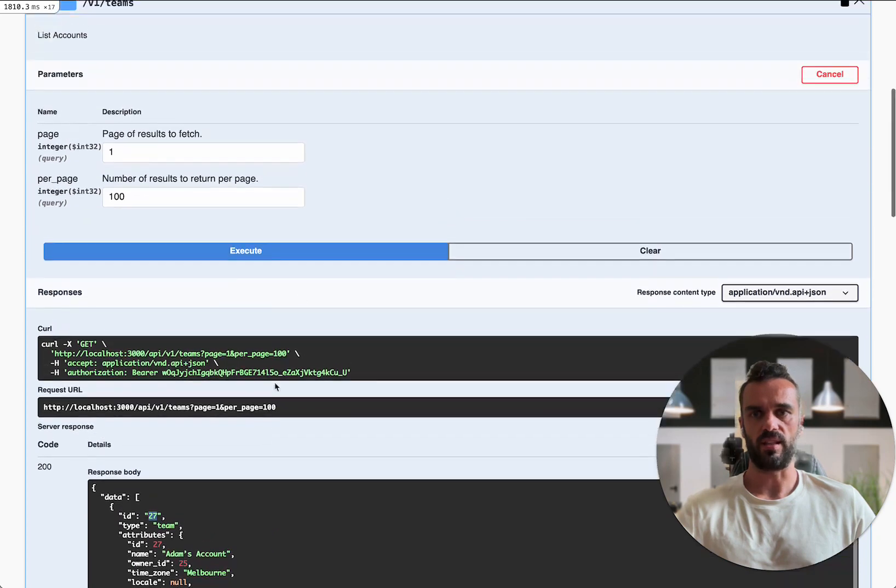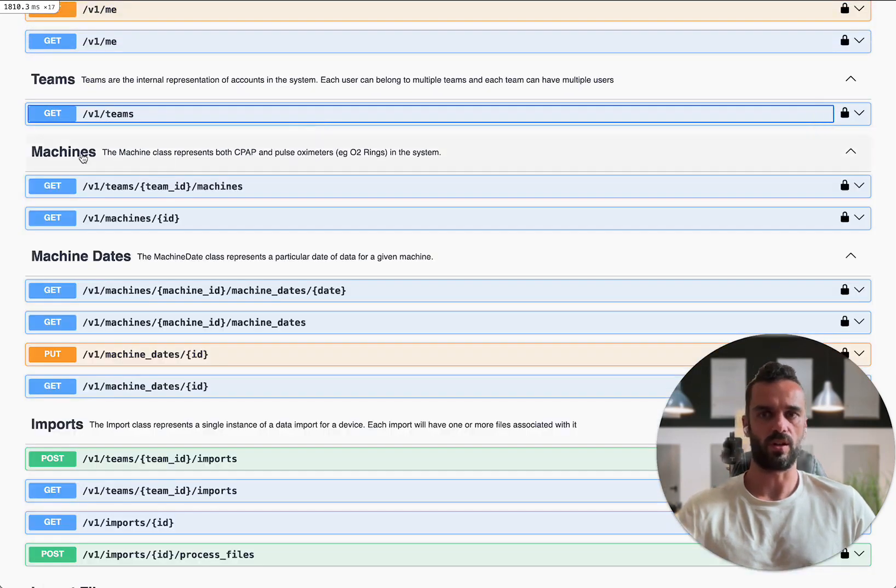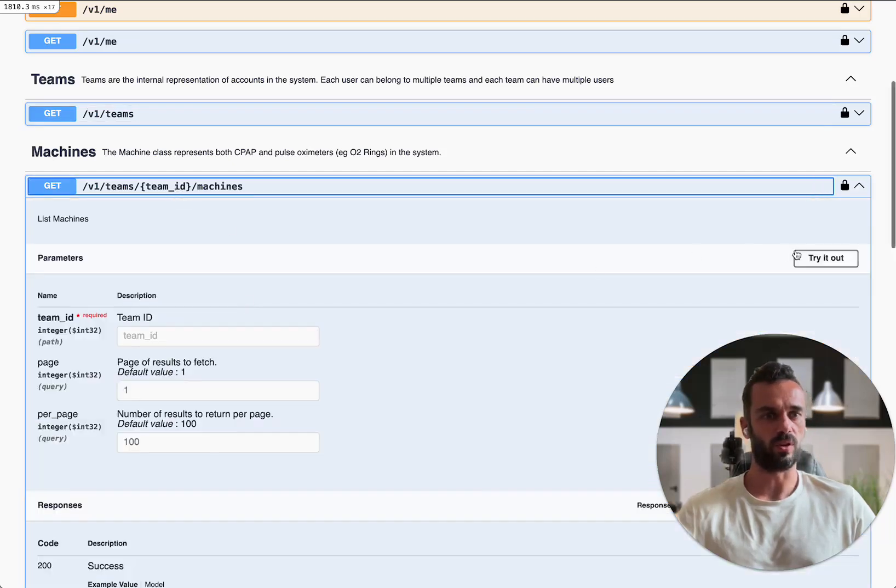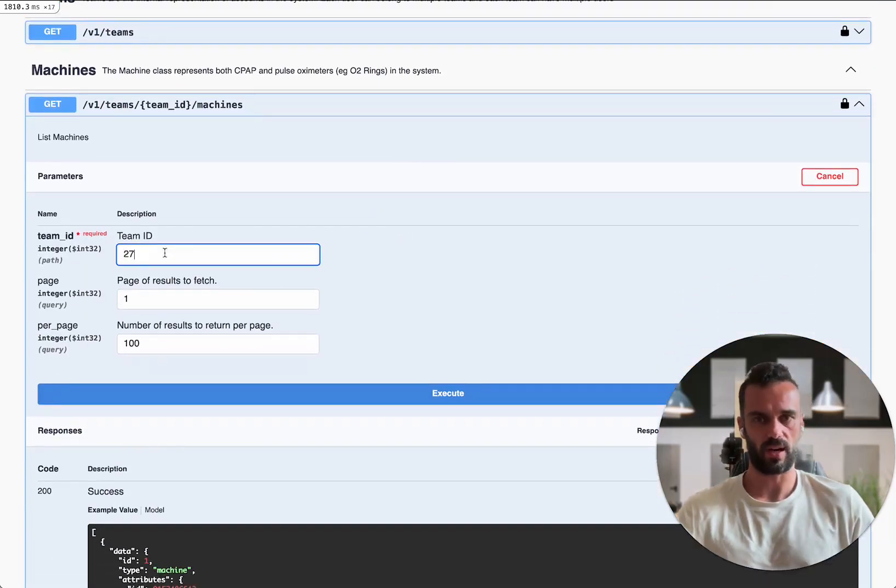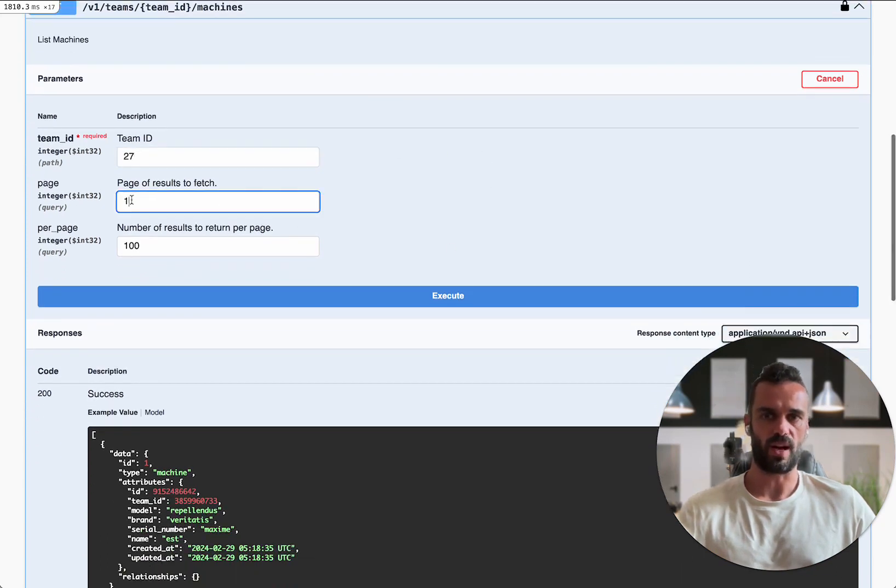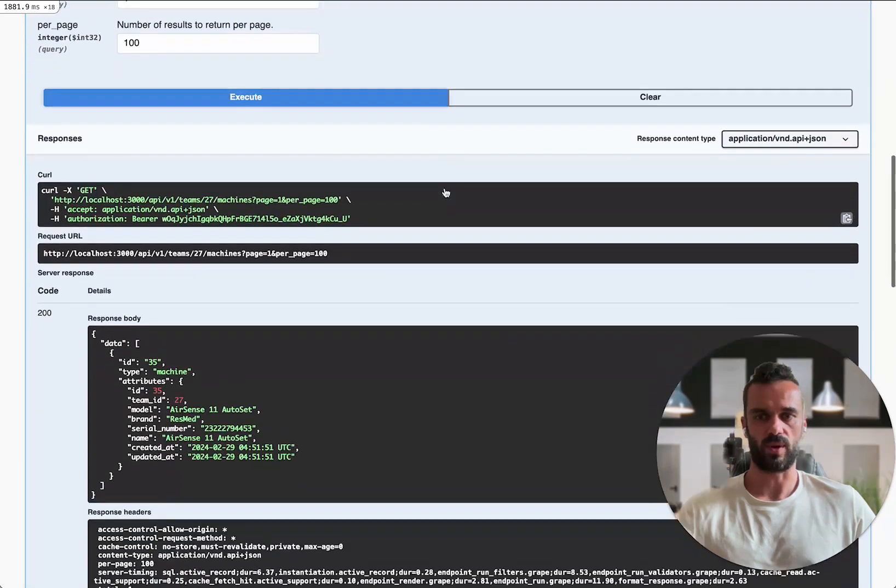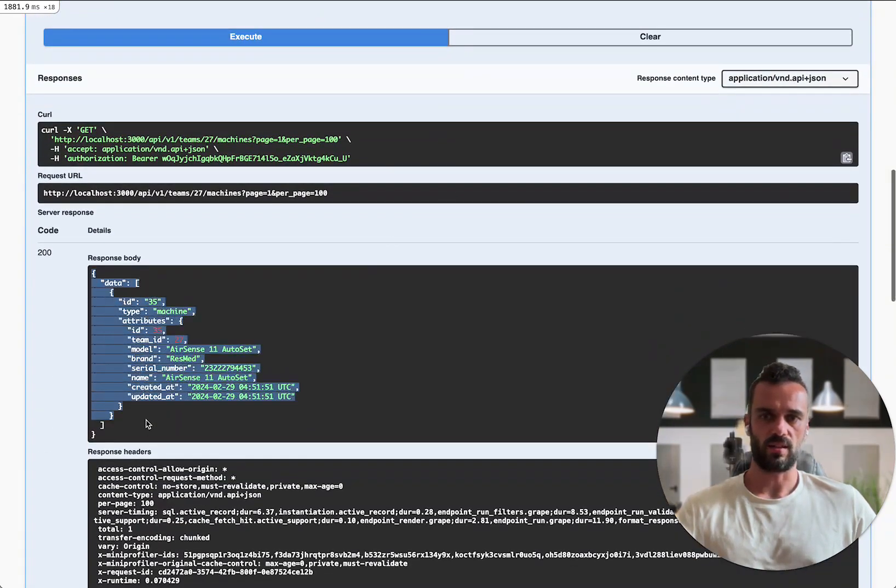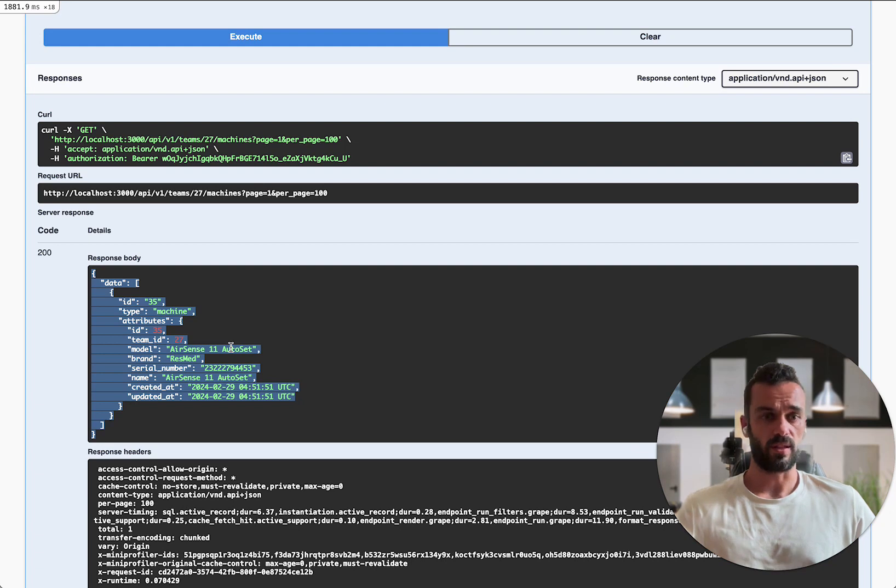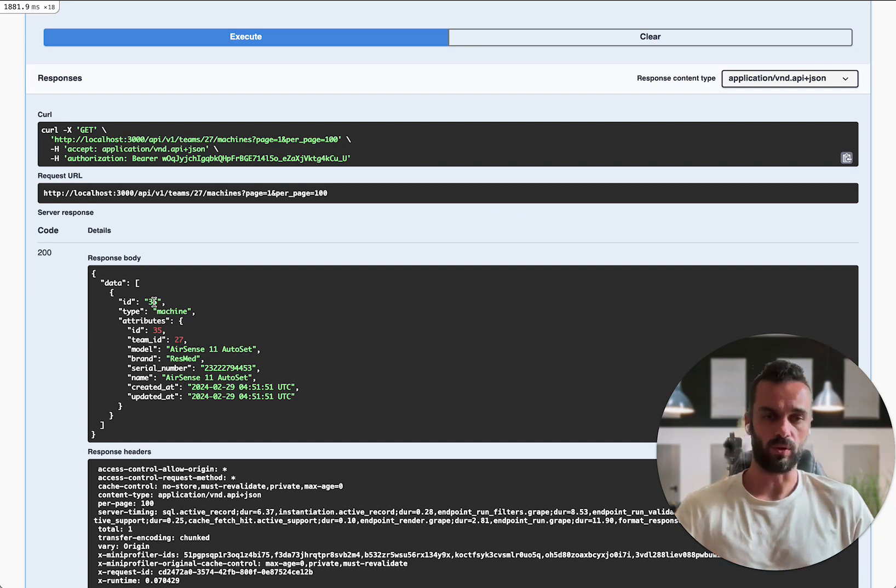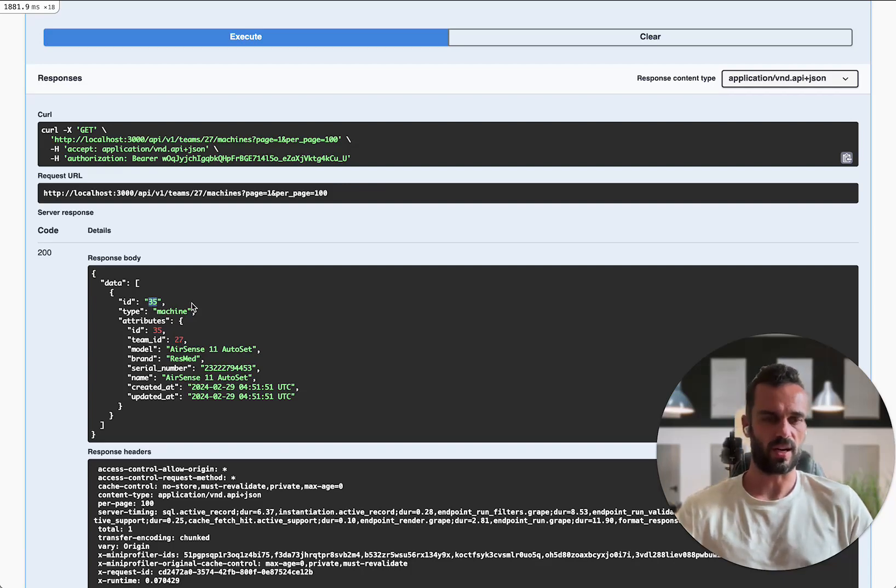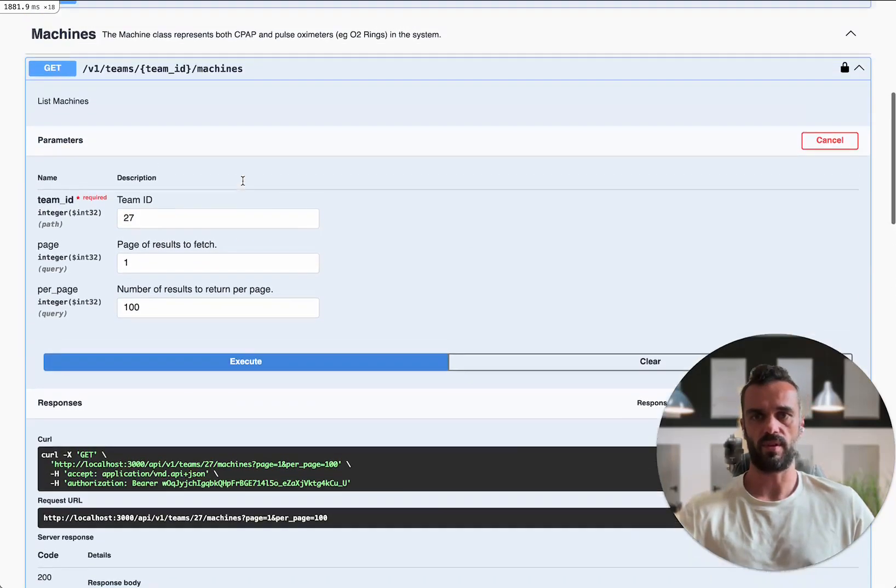So once I've got that ID, now what I can do is go to the machines endpoint and I can use my team ID to query for all of the machines that are in my account. I'm going to throw the team ID in here. You've got your pagination options in there as well. And I'm going to execute this request. So now I can see that this is the CPAP machine that's actually in my account. I've got the name of it, the serial number, all the details about the machine. The thing that I need from here before I can go any further is the machine ID. All CPAP machines in SleepHQ will have their own unique identifier ID number. This one here is ID 35. So I'm going to grab that ID.